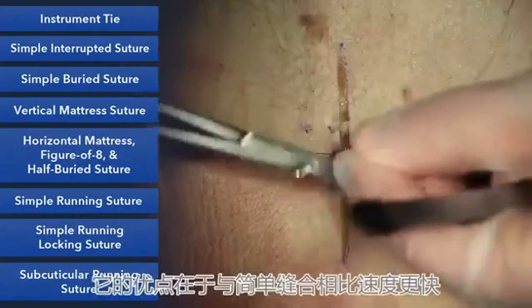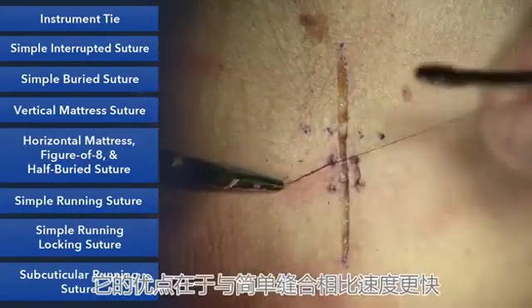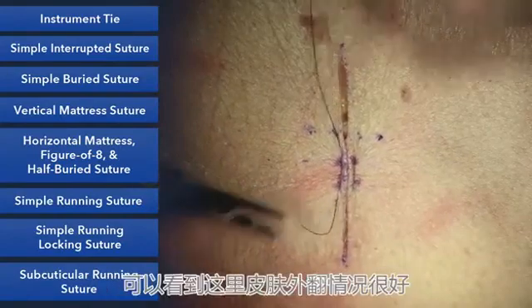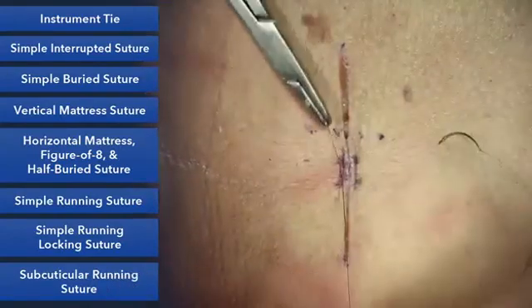The advantage of this is speed compared to doing simple suture. It doesn't evert as effectively sometimes as a vertical mattress. Here you see the way I've placed it, it's everting nicely.